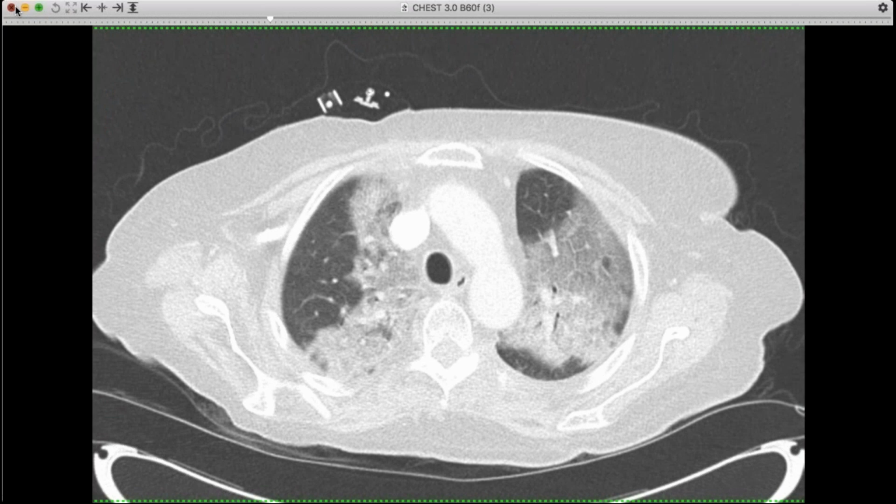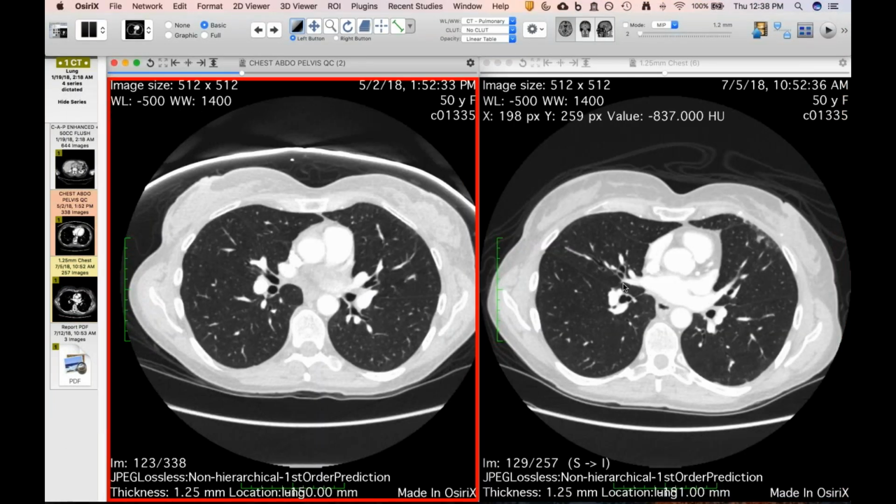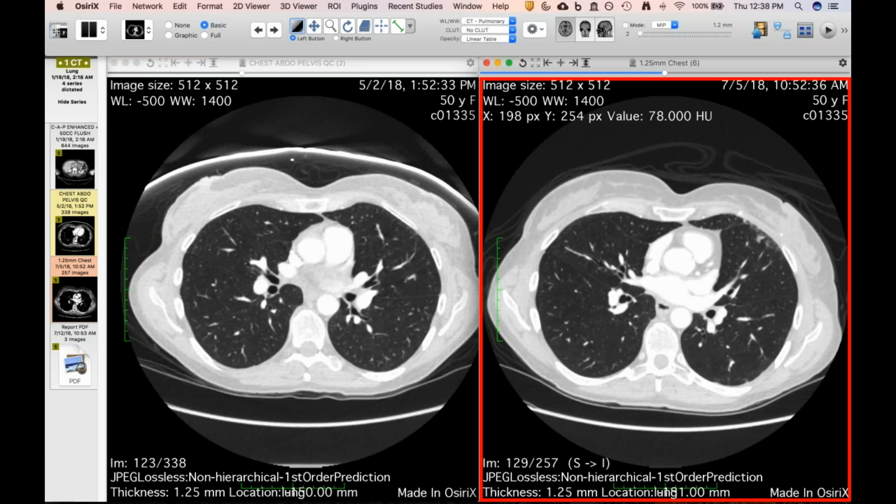Yeah, that's cool. The other phenomenon that is analogous to this is recall dermatitis. I think recall dermatitis is more frequent than recall pneumonitis. So the recall phenomenon does occur in other places like skin. So she is on a drug that was started around the time of the radiation, abemaciclib. It's some sort of inhibitor, the drug that she's on now. So whether it's from the radiation or from the drug, it's some sort of recall pneumonitis then. I like that term.